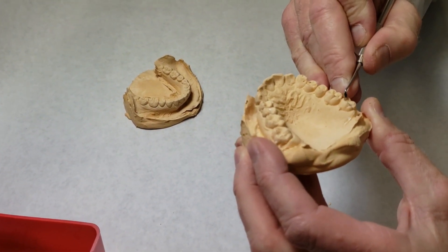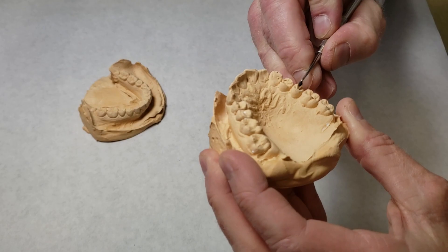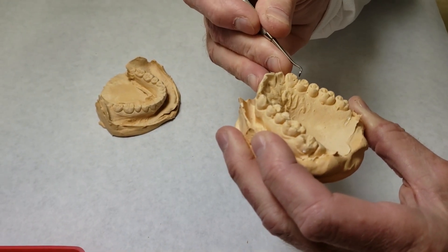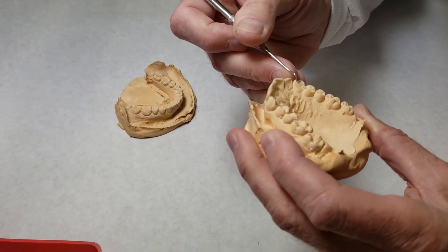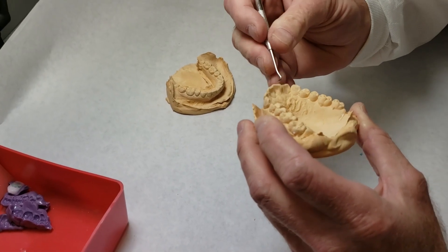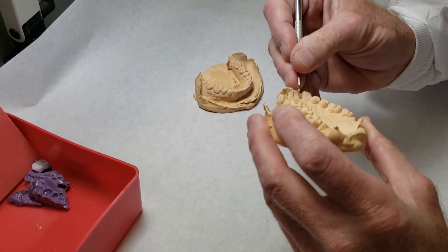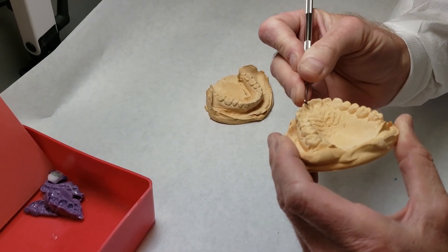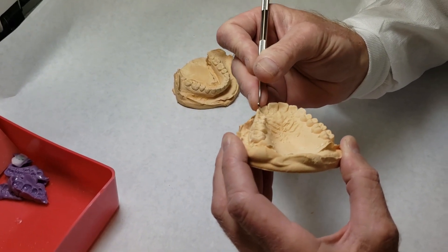You don't want anything positive — anything that's sticking up that's not part of the anatomy. You'd rather have it taken a little bit further down into the tooth so that you don't end up with an inaccurate mounting. We've really got some nasties right there. Most of these probably won't interfere or have any interaction with our wax record, but those could right there.